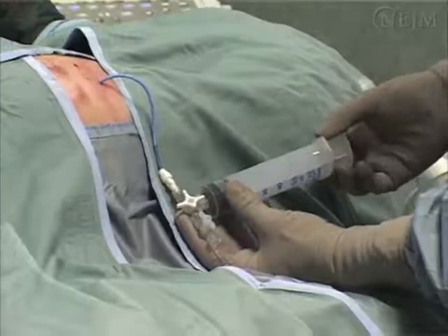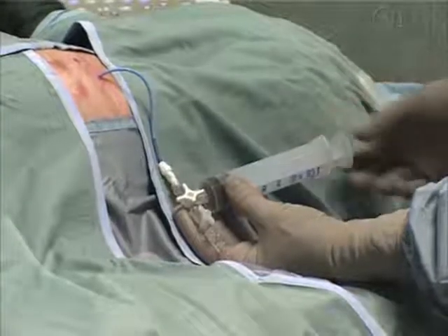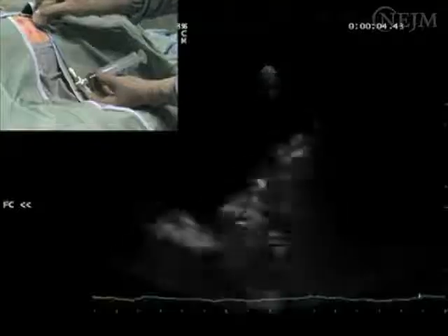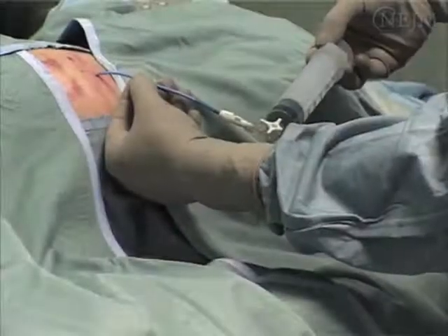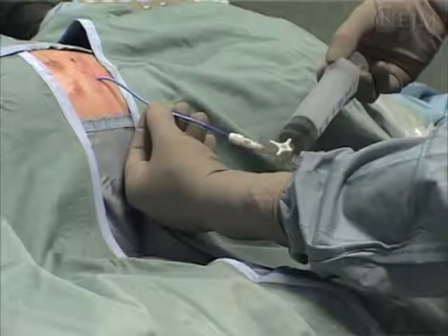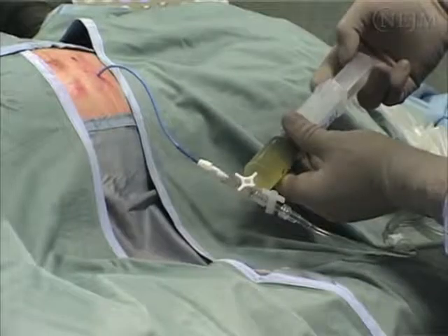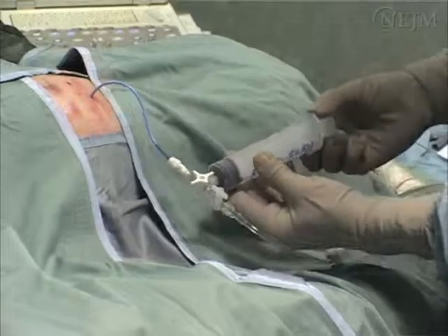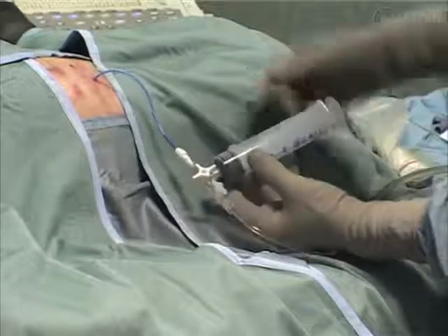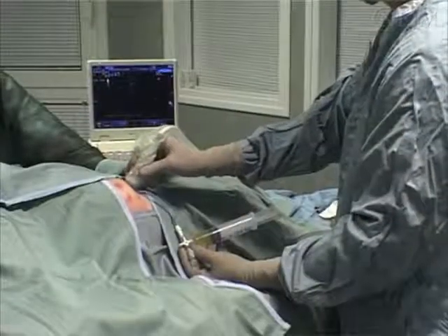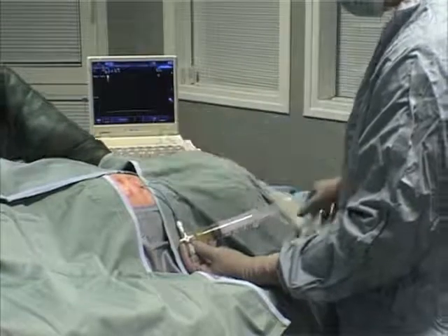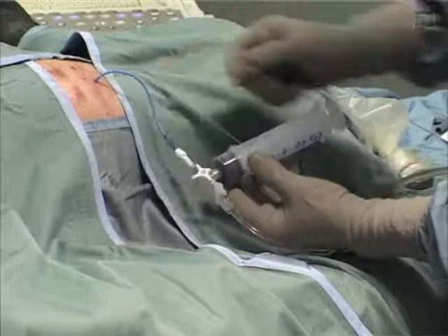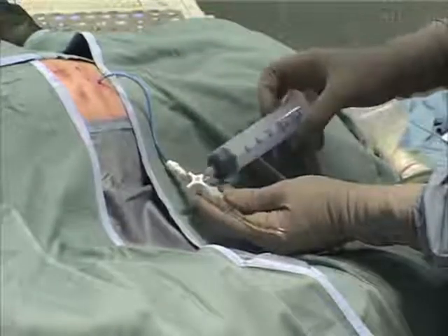Now permit the fluid to drain gradually by gravity, hanging the drainage bag on the side of the effusion, just below the patient. Before securing the catheter, make sure all the fluid has been drained and the effusion can no longer be detected with ultrasonography. If you see residual pleural fluid, slowly pull the catheter out by a maximum of half its length and begin to gently aspirate the liquid, as far as it is possible to drain fluid again without feeling resistance. Repeat this procedure until the residual fluid has been removed. Be sure not to withdraw the catheter too far; the curled end and its perforations should remain within the pleural space. If there is no residual fluid, disconnect the syringe and leave the stopcock open to allow flow from the patient to the collection bag.